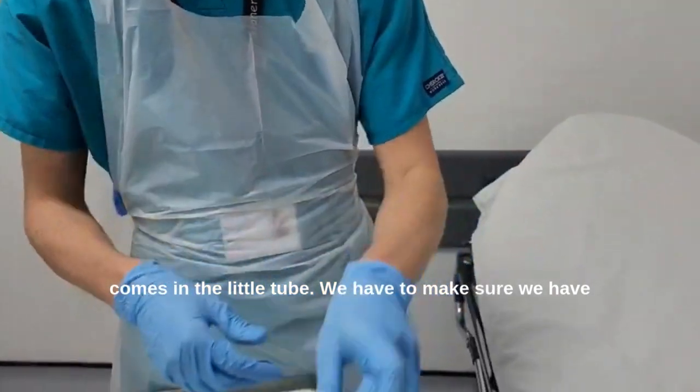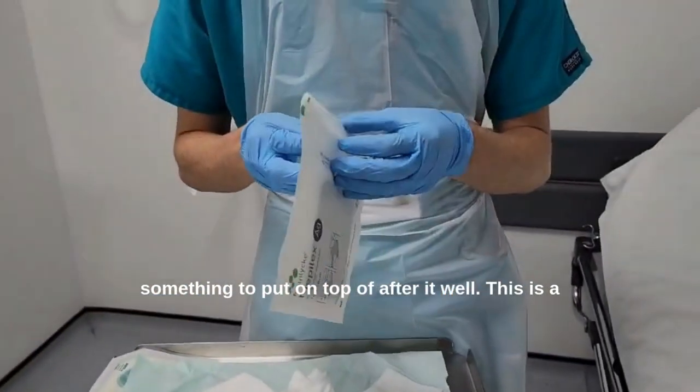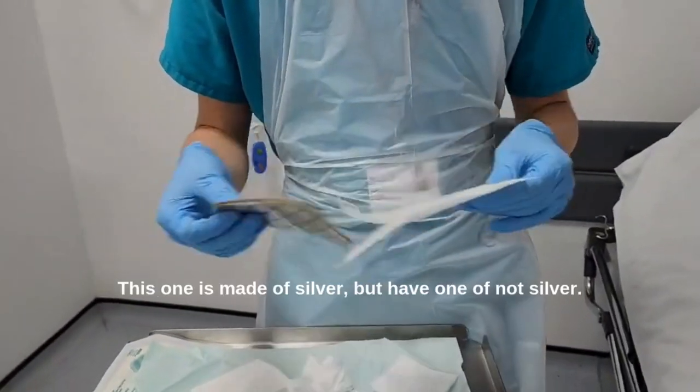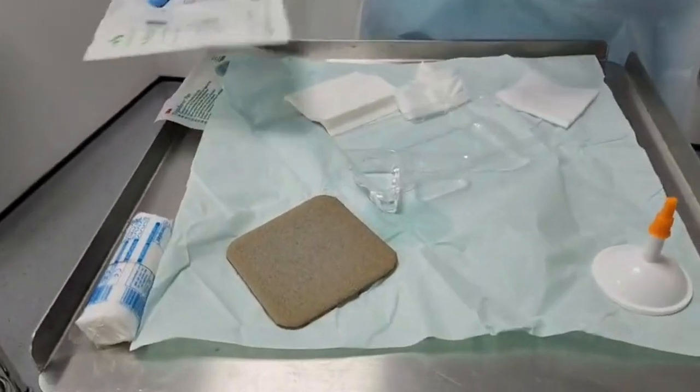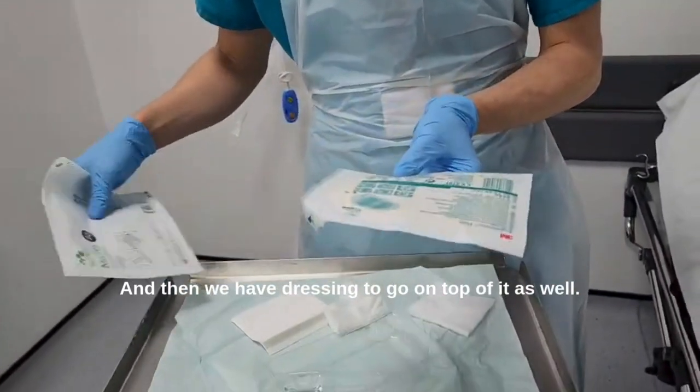The gel comes in a little tube. We have to make sure we have something to put on top of it afterwards as well. This is a non-adherent pad — this one is made of silver, but we have ones that are not silver. And then we have a dressing to go on top of it as well.